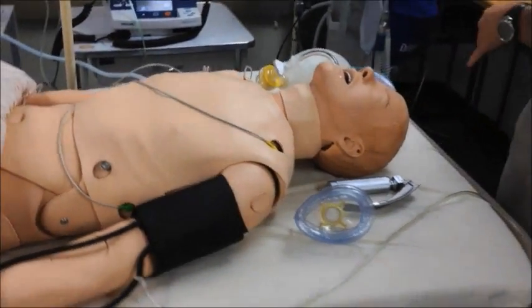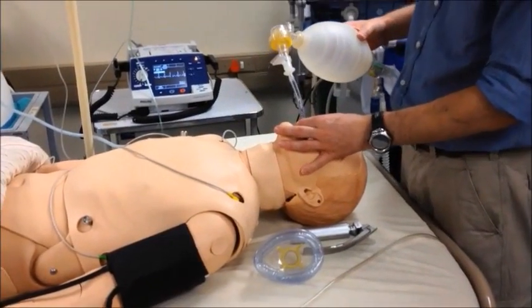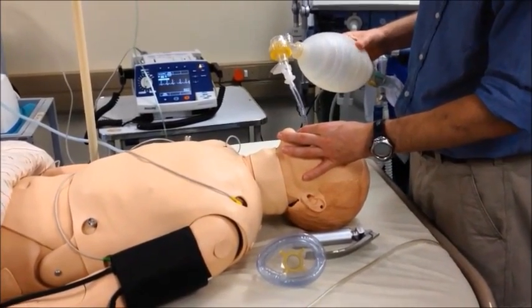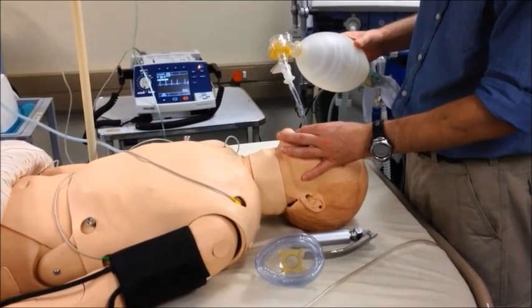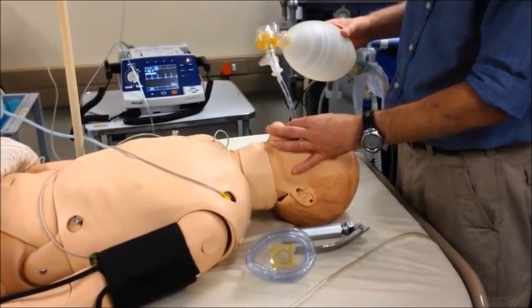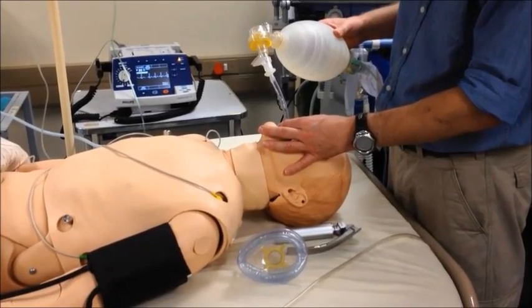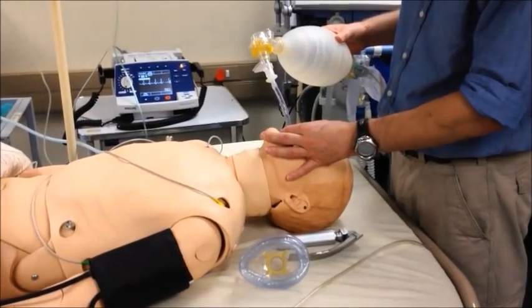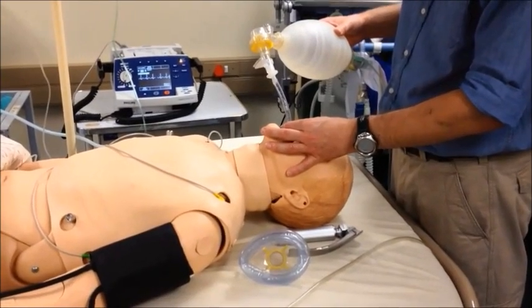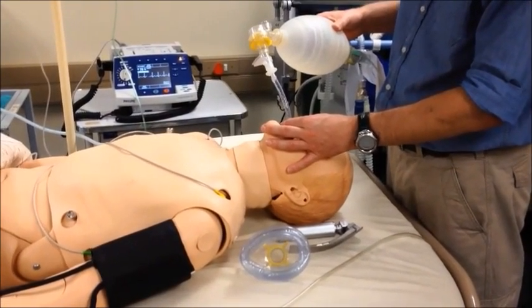If clinical confirmation and secondary confirmation shows that you have had successful placement of your endotracheal tube, you can now secure the tube in place, connect your patient to your ventilator, and proceed with standard post-intubation care. There are many different ways to secure an endotracheal tube to a patient, including tape and tie techniques and commercial devices.